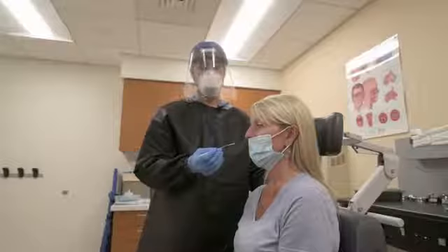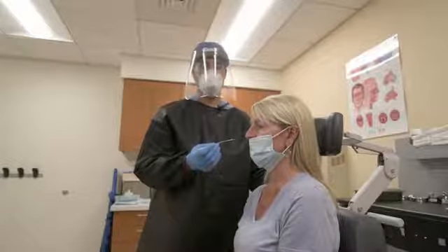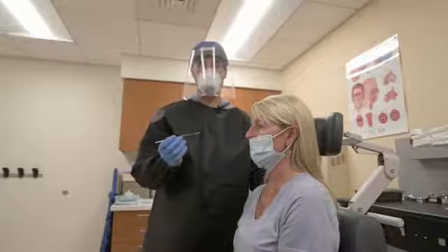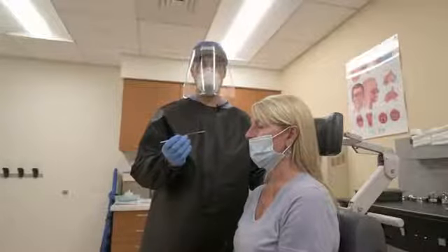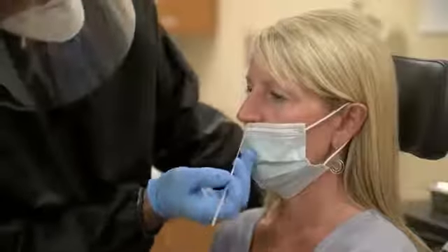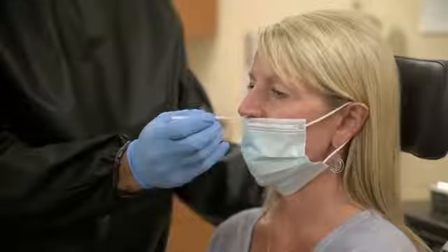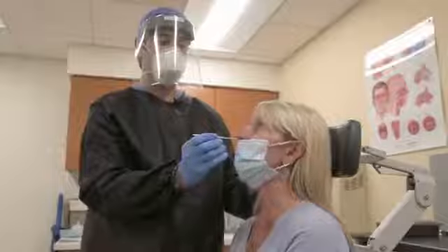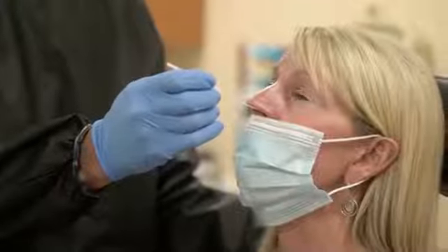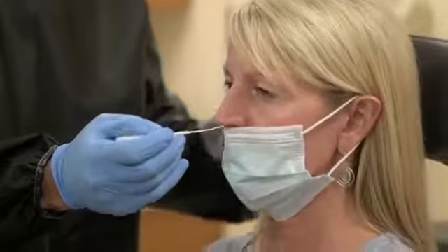If a patient moves their head during the procedure, temporarily pause the procedure and correct the head position before continuing. Sometimes this would require fully removing the swab, talking to the patient, and then reinserting on the same side to ensure an adequate test. So to demonstrate, if we're in the nose and as we proceed posteriorly, the patient extends their head, you may need to correct by changing the trajectory of your own hand or simply having the patient correct back into the neutral position.